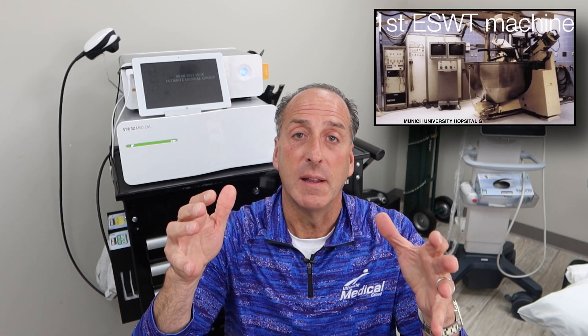So when did focused shockwaves start? The first focused shockwave machine was used in 1980 in Munich, Germany — and that was for a kidney stone. It was a big machine, and that's when they blasted up a kidney stone. That same technology, lithotripsy or focused shockwave energy, is still used today. The machine looks a lot different, a lot more advanced, but that was 40 years ago.